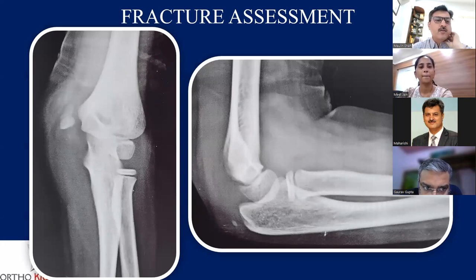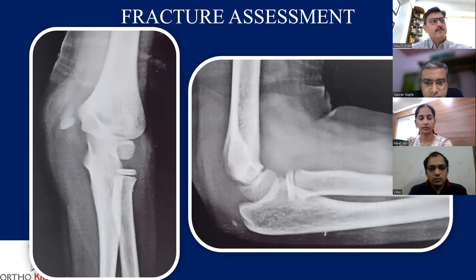So Goda, let's stop here. And Gaurav, would you read this X-ray? Yes, sir. So I feel there is a fracture of the medial epicondyle. It's a displaced fracture. And apart from that, other aspects look normal to me. Right.